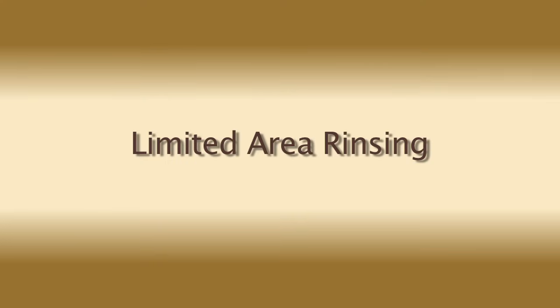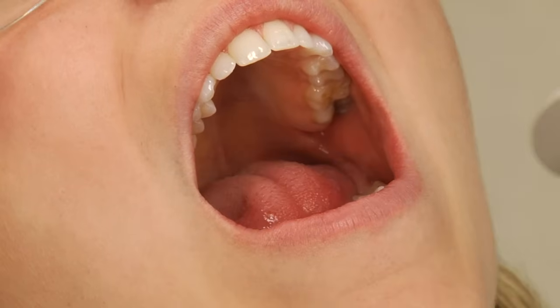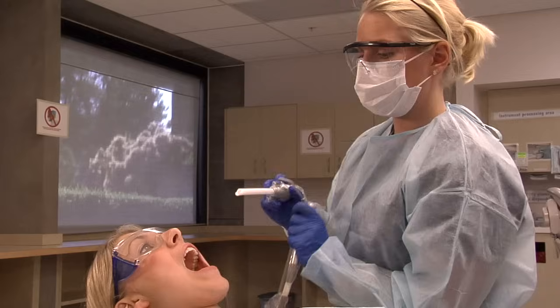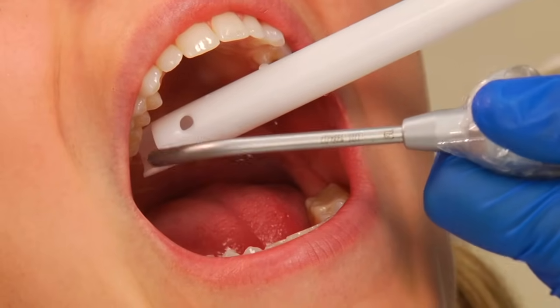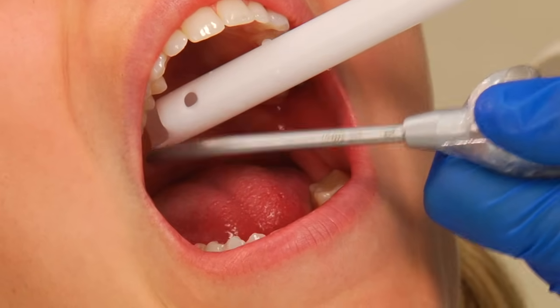Limited area rinsing is performed frequently throughout a procedure as debris accumulates during the preparation and restoration of a tooth. This rinsing must be accomplished quickly and efficiently, causing no delay in the procedure. This occurs mostly when the dentist exits the mouth and pauses for inspection.